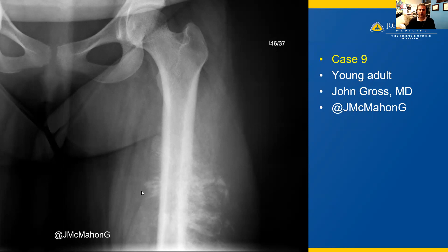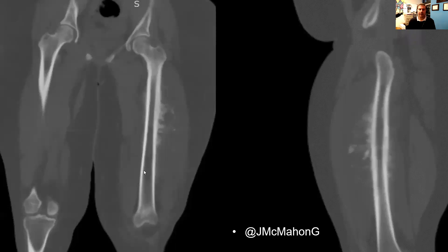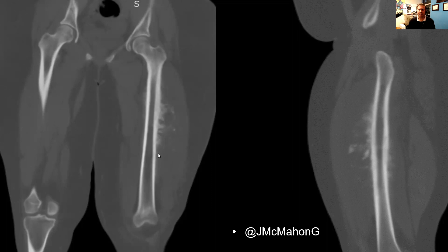In order to better define these radio densities, a CT scan was performed. Here we have in the bone window on the left a coronal section, and on the right a sagittal section. We have this ill-defined bone-forming tumor that arises on the surface of the bone — quite large, going out into the soft tissues. And on the right, anterior and posteriorly, this tumor was encircling this long bone.